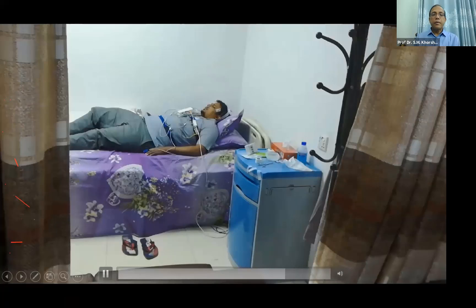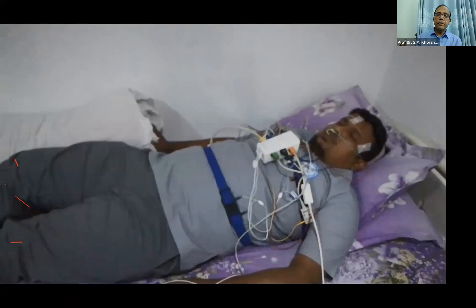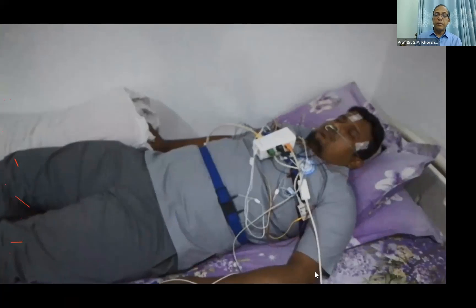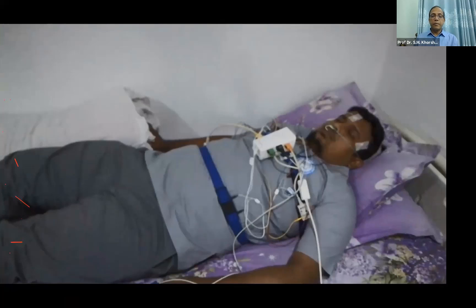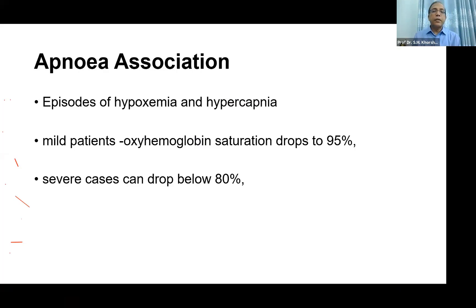This is the real recording. This shows apnea association — episodes of hypercapnia and hypoxemia.